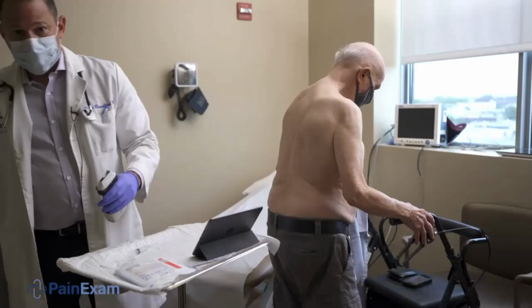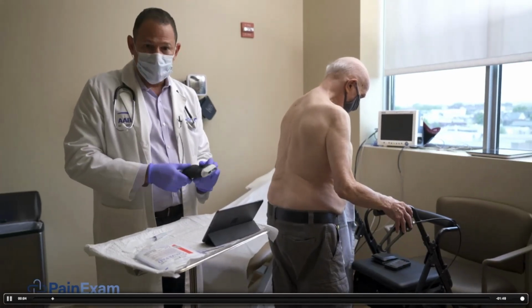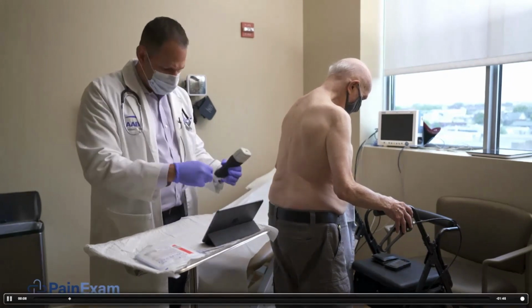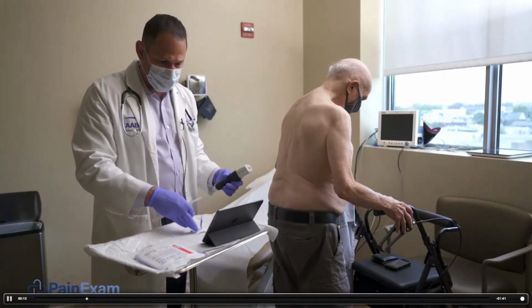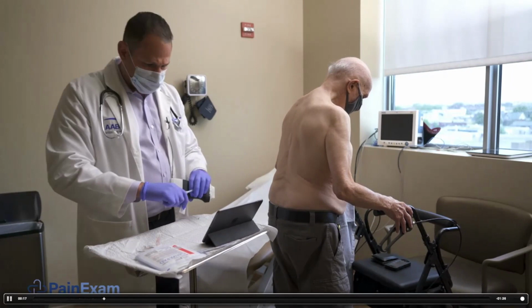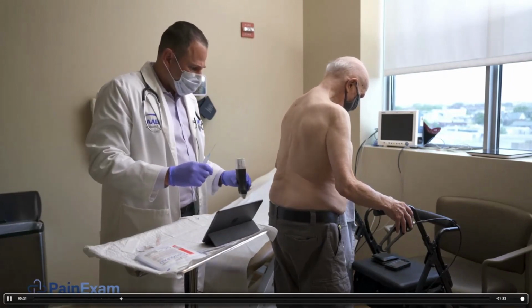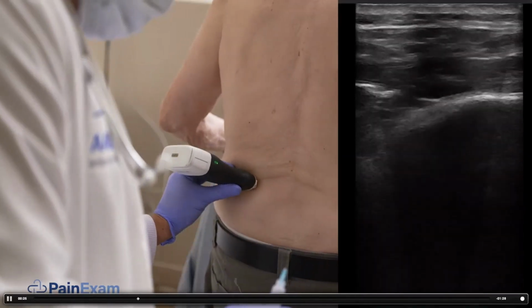There's another patient. We're going to anesthetize the lateral branch of the superior cluneal nerve. Patient had a fall and is complaining of pain in the region. The cluneal nerves originate from the dorsal ramus of the upper lumbar levels, and they run down towards the buttock and give branches that innervate the region near the iliac crest as they pass over it, as well as even to the lateral aspect of the hip.